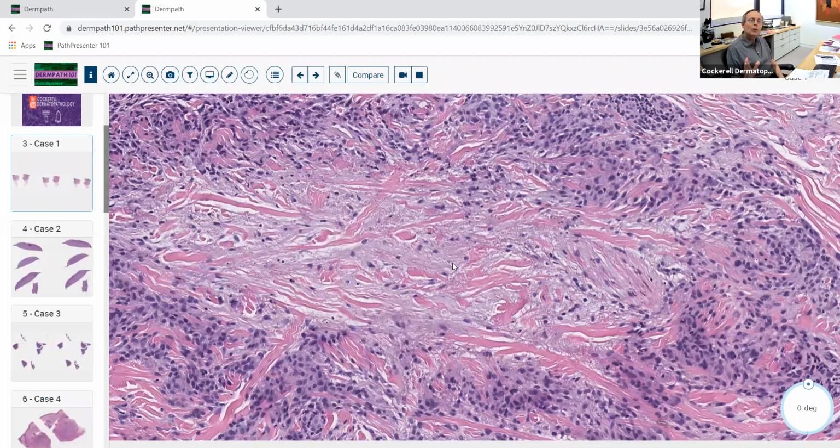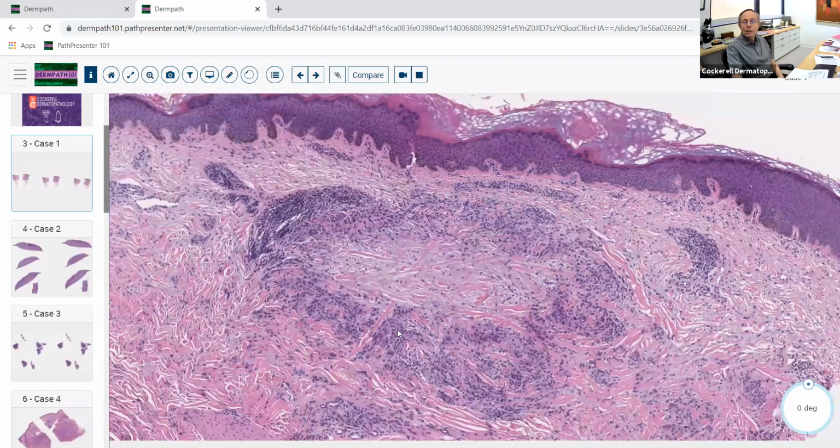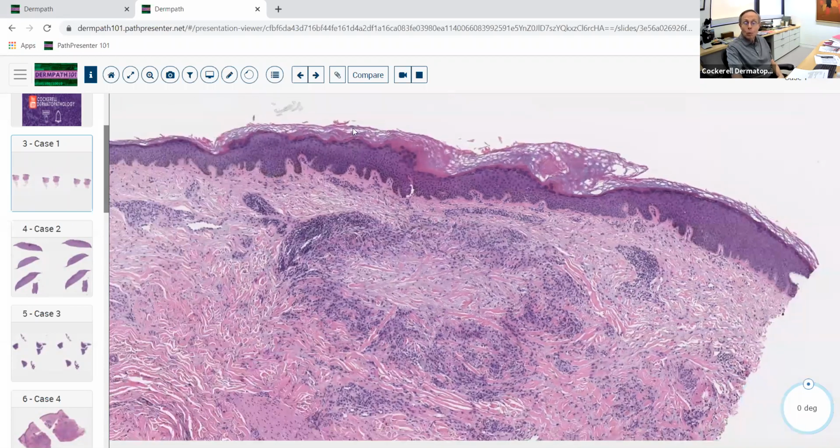Now, I'll just tell you that in some cases of rheumatoid nodule, you can see some mucin. In some cases of so-called subcutaneous GA, pseudo-rheumatoid nodule, you can see some fibrin, and the patient doesn't have to have 1 iota of rheumatoid disease. So there's some overlap here. And you can sometimes get some degenerated collagen in the center of granuloma annulare. But just remember that this is the general pattern, and if you use this, it works well.